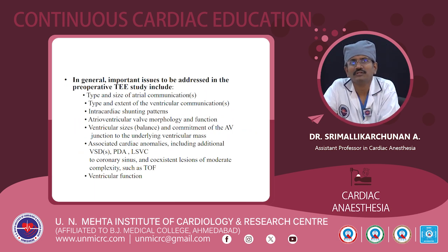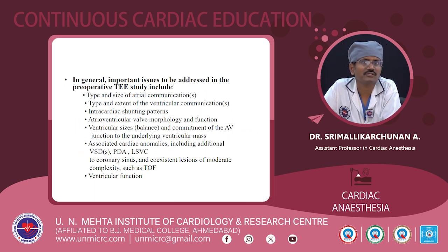In general, the important issues to be addressed in the preoperative TE study should include the type and size of the atrial communications, the type and extent of the ventricular communication, intracardiac shunting patterns, atrioventricular valve morphology and function, ventricular size and commitment of the atrioventricular junction to the underlying ventricular mass, associated cardiac anomalies, namely an additional VSD or PDA or presence of a left superior vena cava to coronary sinus, and coincidental lesions of moderate complexity such as tetralogy of Fallot, and to evaluate the ventricular function.